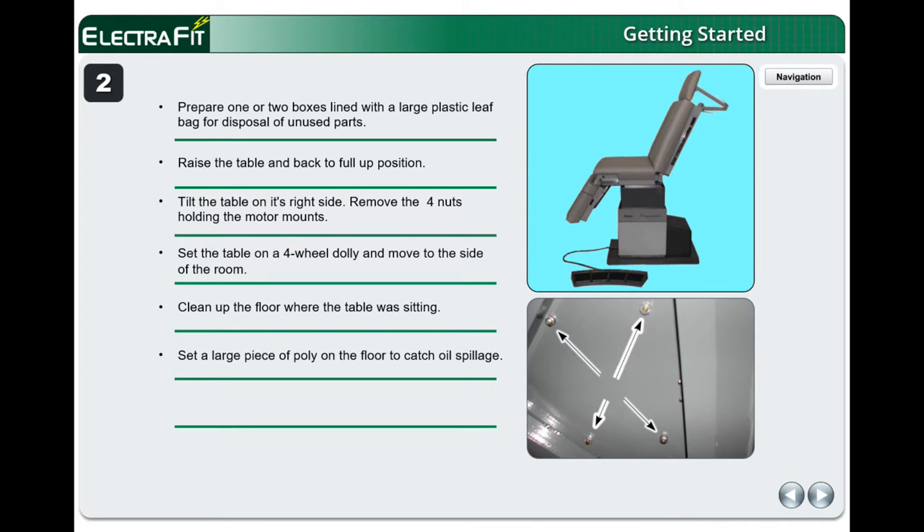Set a large piece of poly on the floor to catch oil spillage. Move the table back over the poly. The table is to remain on the four-wheel dolly during the installation process.